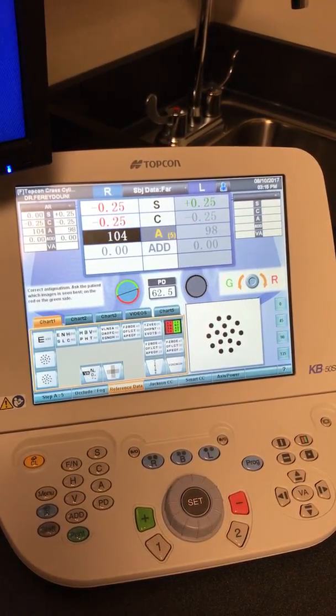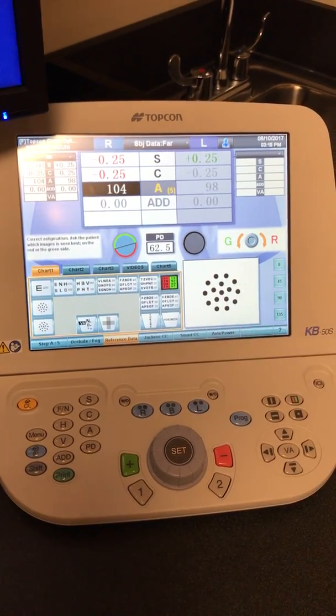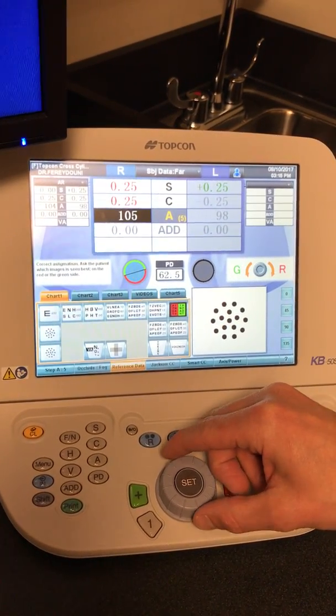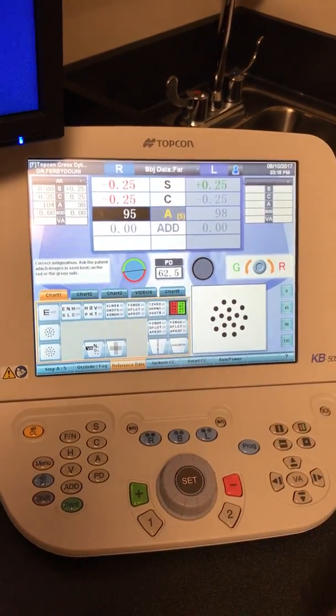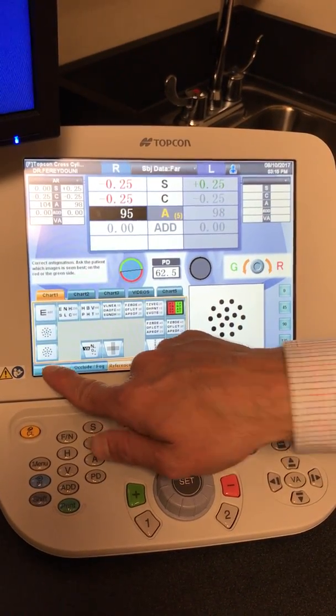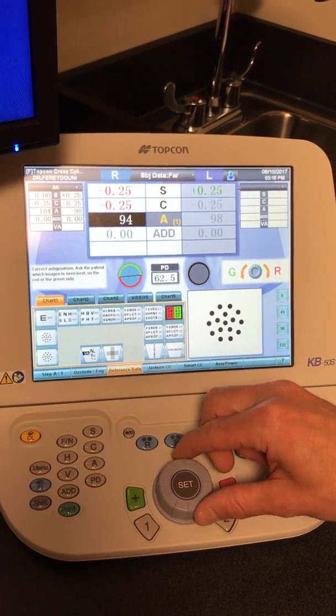It'll move on to the JCC portion of the exam. The JCC portion uses the dots and the same thing — which is clearer, the red or the green — and you would follow it to the left or to the right. You'll notice those are in five-degree increments. If you want them in one-degree increments, you'd hit the button down on the bottom left, and it will move them in one-degree increments.